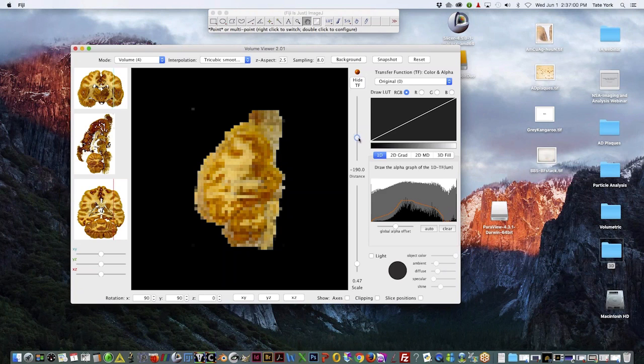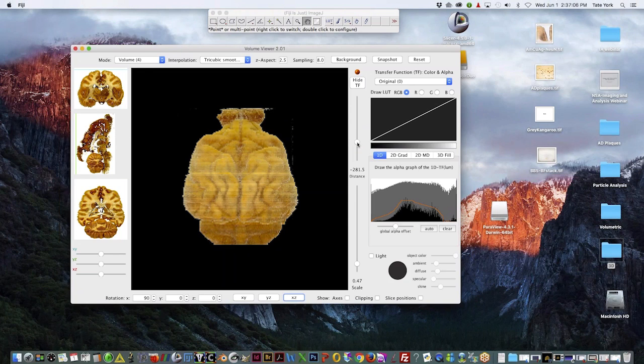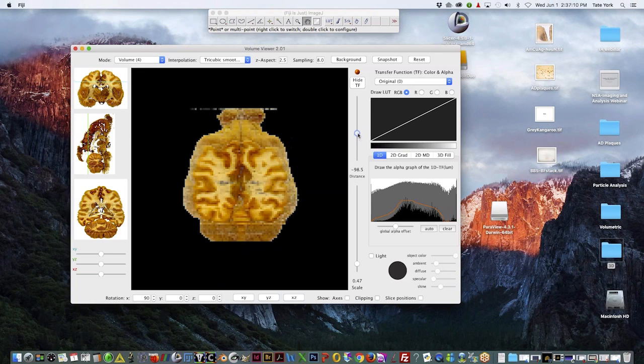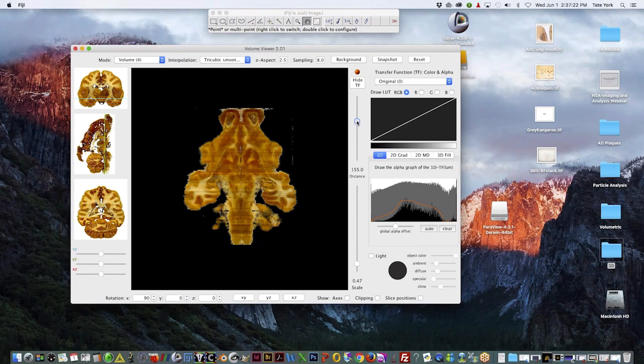So what I also put together is a stain set of the grizzly bear brain. We stained with a Nissl thionin stain, and we also stained with a myelin stain. The next volume that I'm going to show you is of the myelin stained slide set.